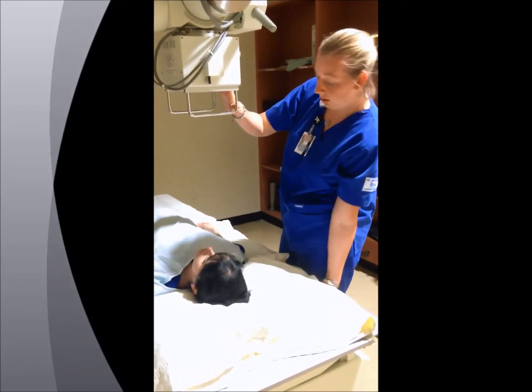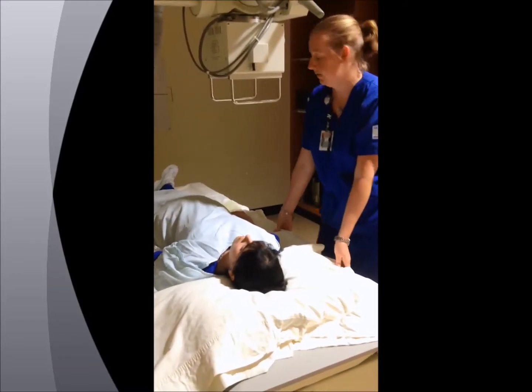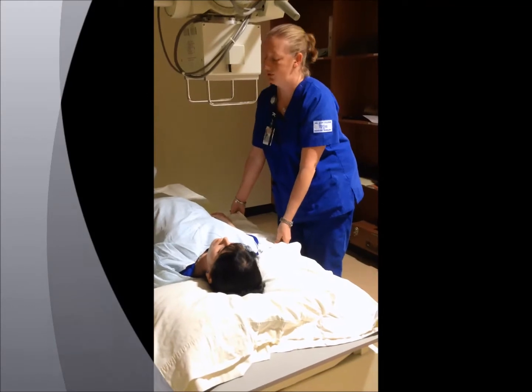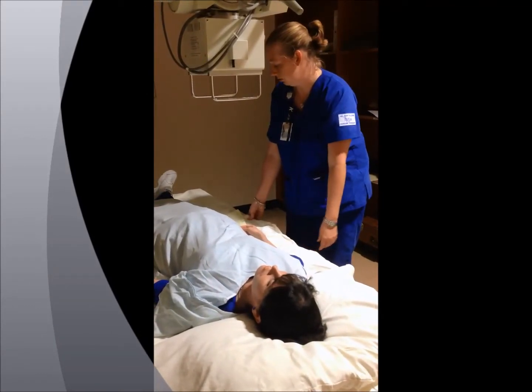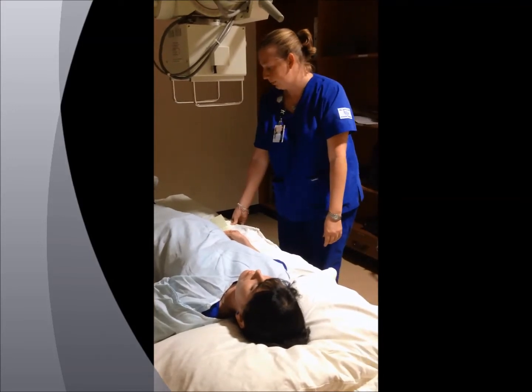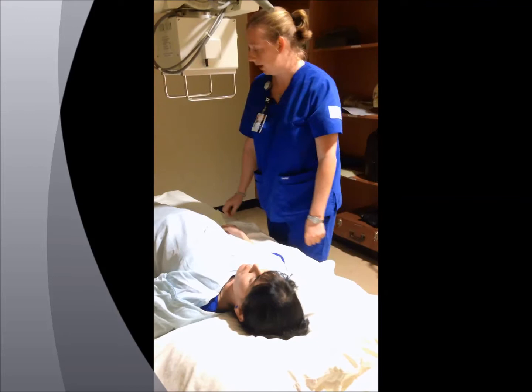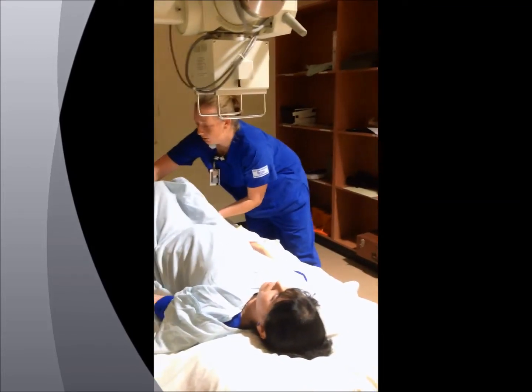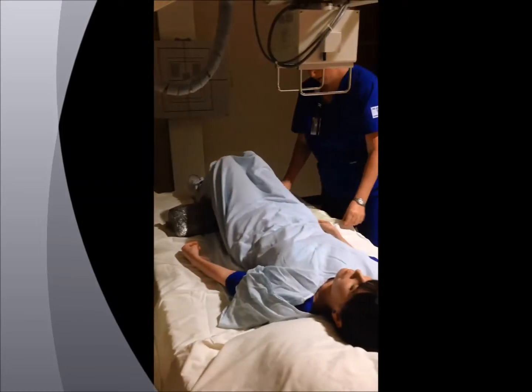before you get started. Once you've got that lined up, you can actually just move the patient instead of moving the tube. You're going to make sure you shield the sensitive areas, thyroid and the genital area. The patient's going to be supine with their arms at their sides, head on a pillow for comfort, and you're going to flex their knees. You can use a lucent sponge to reduce any curvature in the spine.